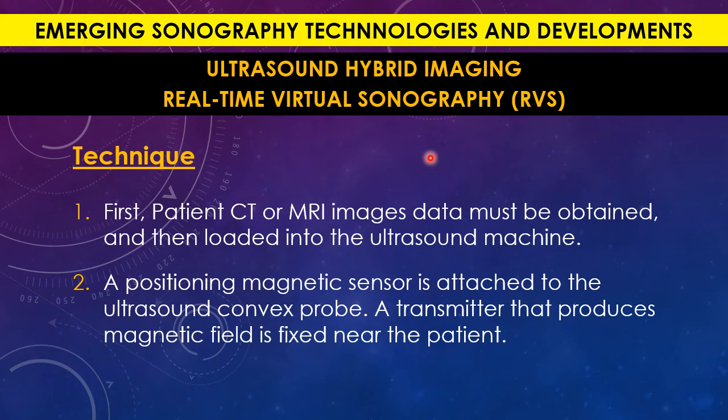So how is this technique of ultrasound hybrid imaging done? The patient you are scanning currently has already been scanned by CT or MRI, and these data are saved or loaded to the ultrasound system, which is part of our workstation.